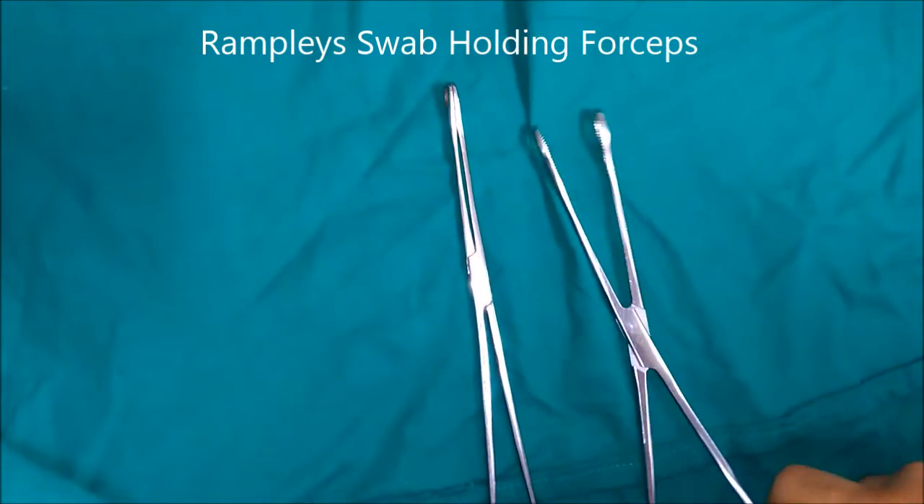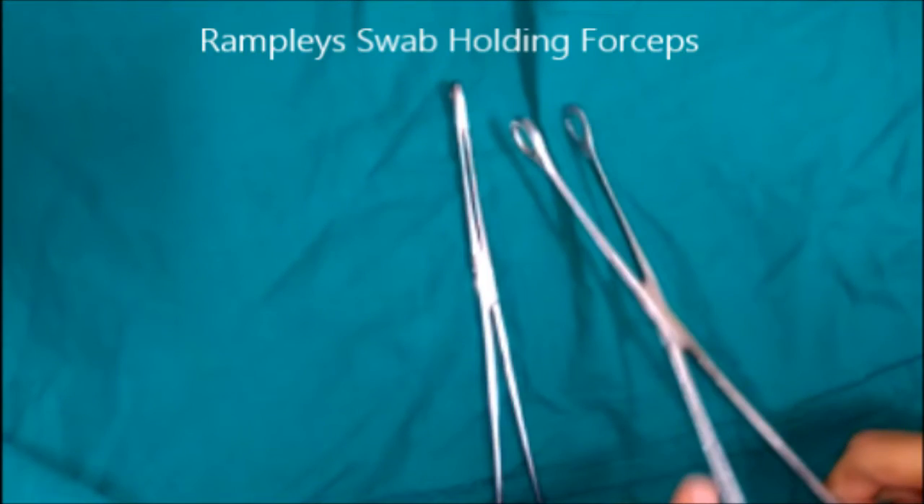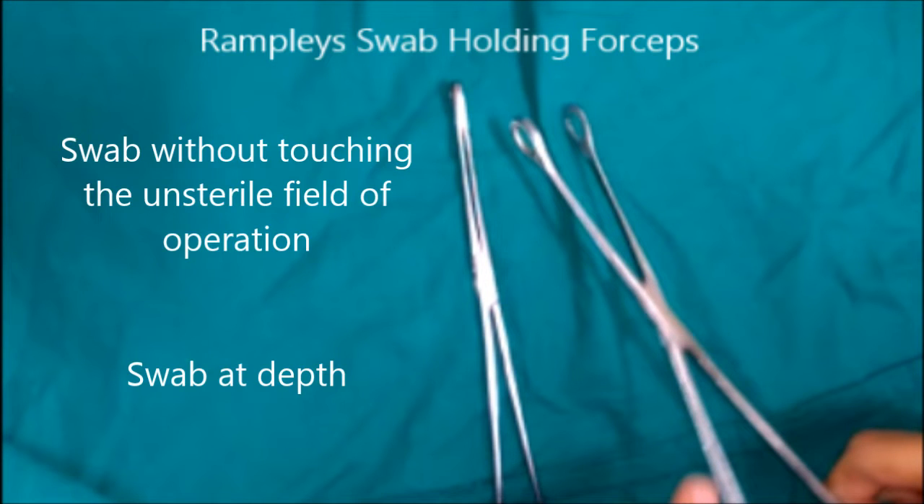This is Rampley's swab holding forceps. It is a long instrument in which the blades are oval, fenestrated, and provided with serrations on the inner aspect. The instrument is long so that the surgeon is able to apply antiseptic solution to the skin without touching the unsterile field of operation, and so that swabbing can be done at depth. For abdominal operations, the skin from mid-chest to mid-thigh is cleaned.